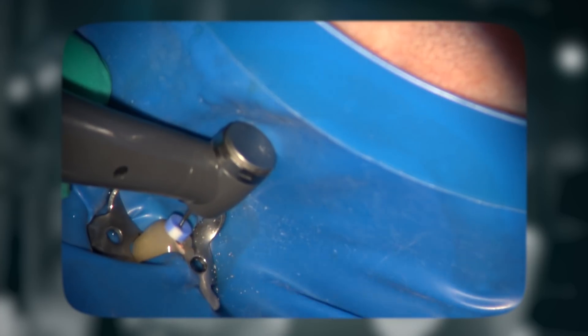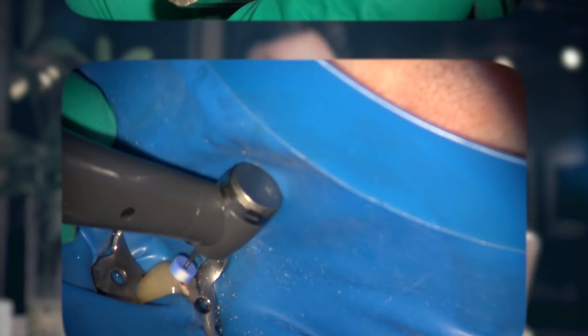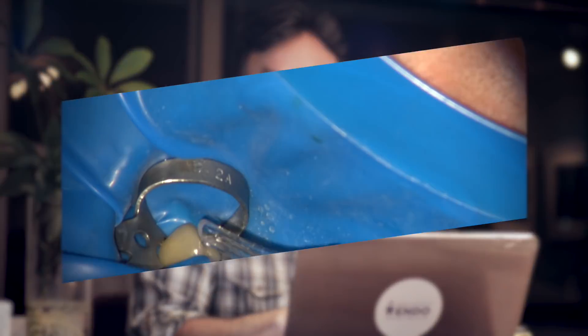Once the 3D shaper file reaches the full length, I record this length using my endo ring, and then the 3D finisher size 30 file is used here also at 1000 RPM to remove any remaining gutta-percha on the walls beyond the reach of the shaper. A higher RPM can be used if the filling material is hard — generally I recommend 1000 RPM, but you can go as high as a couple thousand RPM in that situation.